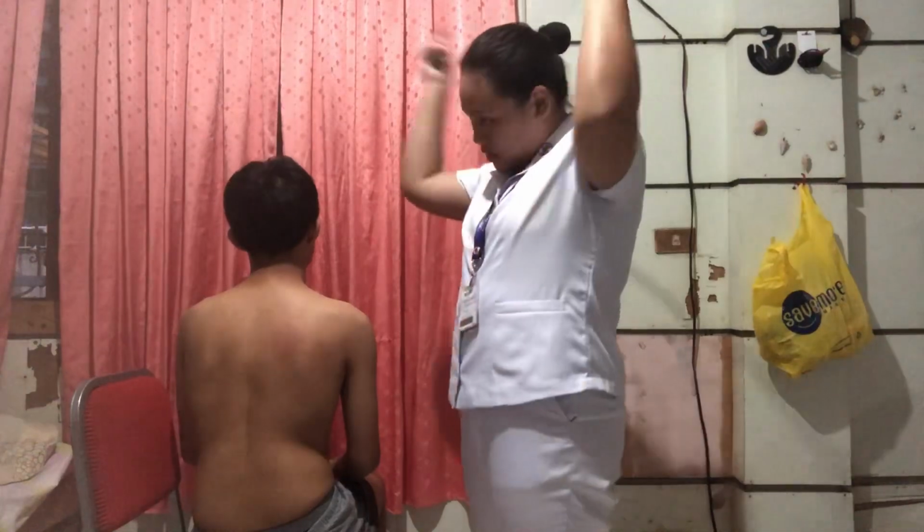Now I'm going to auscultate for breath sounds using the systematic ladder pattern. Now I'll be listening to your breath, sir. So I need you to inhale, exhale. I'm going to use my stethoscope.